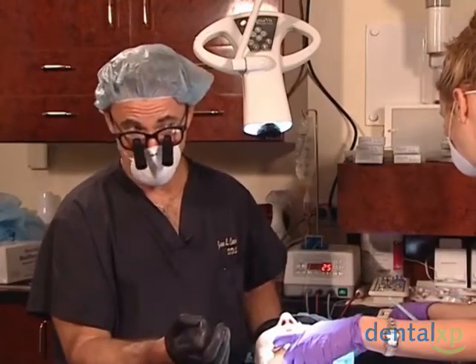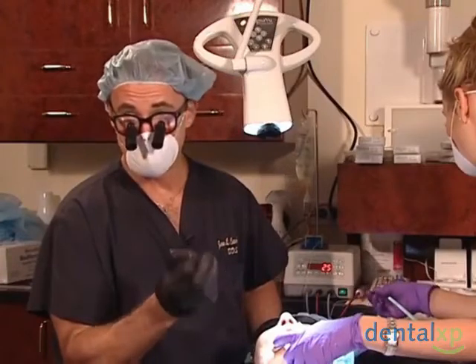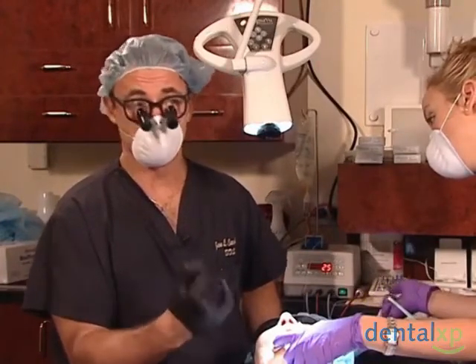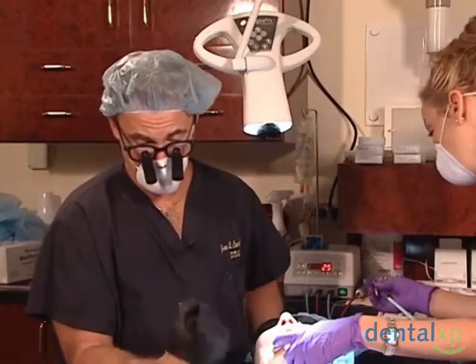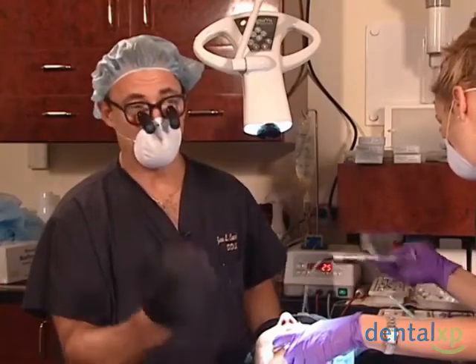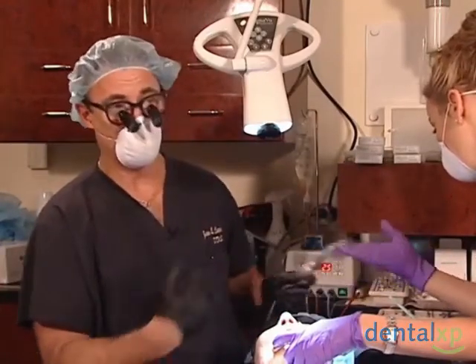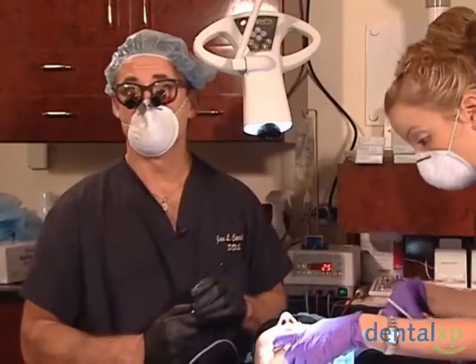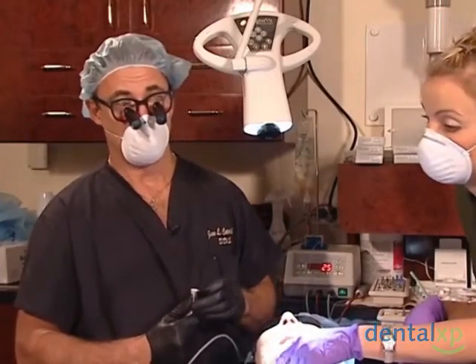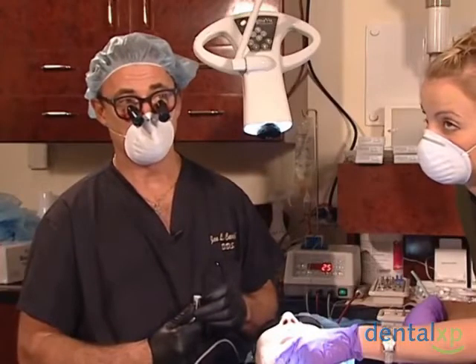So what would I do? Would I use a smaller implant, or would I go in with my 1.6 burr and engage that cortical plate so that now I have a purchase for this implant to go a little further down? And the answer that I use is the second. So I'm going to take this implant out, and on our treatment plan, we knew that the cortical plate in that area was up to 1,500 Hounsfield units, which is type 1 plus bone, very, very dense. And in a couple areas we're going to be right at that limitation.